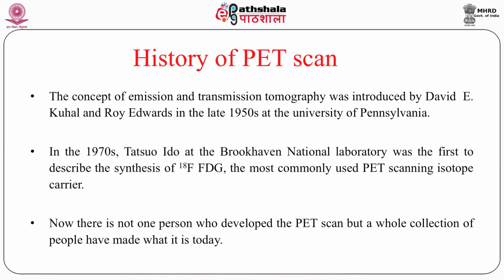So PET is basically positron emission tomography, but the transmission tomography concept of this particular technology was first given by David E. Kuhl. Going to the 1970s, Tatsuo Ido at the Brookhaven National Laboratory was the first to describe the synthesis of fluorine-18 FDG, the most commonly used PET scanning isotope carrier.